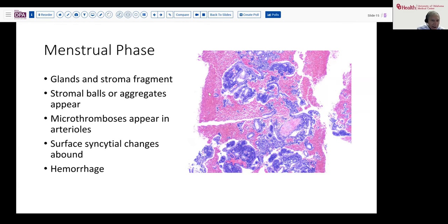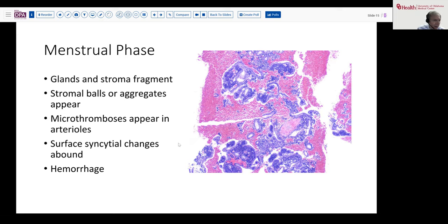That leads then to a menstrual phase where the glands and stroma fragment or condense more fully. You see these stromal balls, which may have a thin surface epithelial lining around them — very blue central cores with surrounding epithelial cells. You may see some microthrombi and then the surface syncytial change along with lots of hemorrhage in the background.